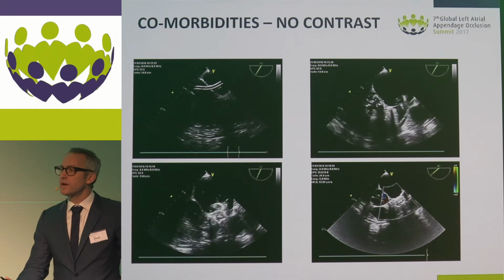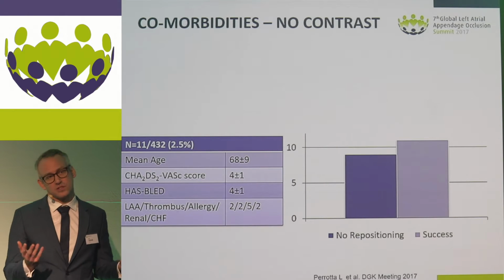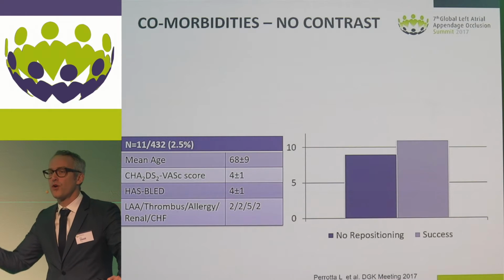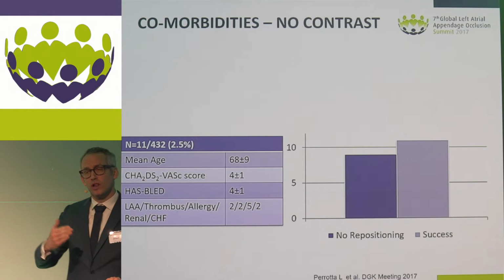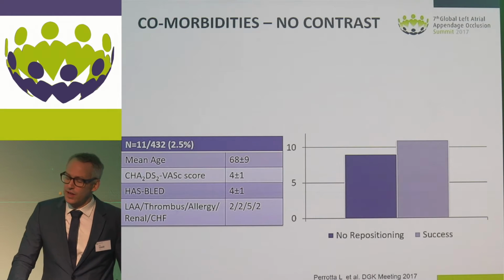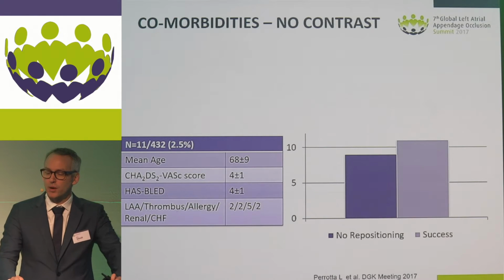What are our experiences with this? This is not a single case. Until today, we have performed 11 cases, so it's a small case series, of course. And as you can see, out of 432 implants that are in our database, that equals 2.5%. I have to admit that I became a little more liberal in doing this after I gained confidence that this is a safe and an effective approach. So I guess one could choose even more patients for a contrast-free approach.